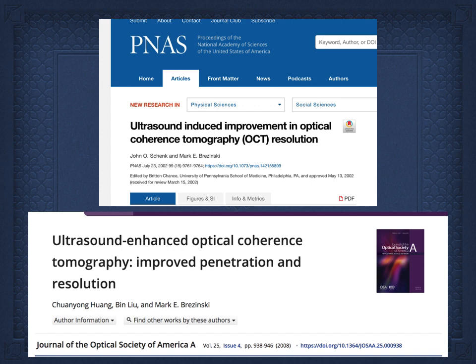But if the light scatters around, multiply scatters, it has a lateral component, not just into the tissue, but going sideways. This is a very classical view, and as somebody who does quantum mechanics, it's sort of disturbing explaining things this way, but we'll just use this for illustrative purposes. Now that ultrasound beam, it's called a photon-phonon interaction, the ultrasound frequency is picked up by the photon of multiply scattered light, but not single scattered light. It frequency shifts it, so when it returns back, it's outside the bandpass filter, the filter that allows only certain ranges of light to be detected, and you've just removed multiply scattered light.